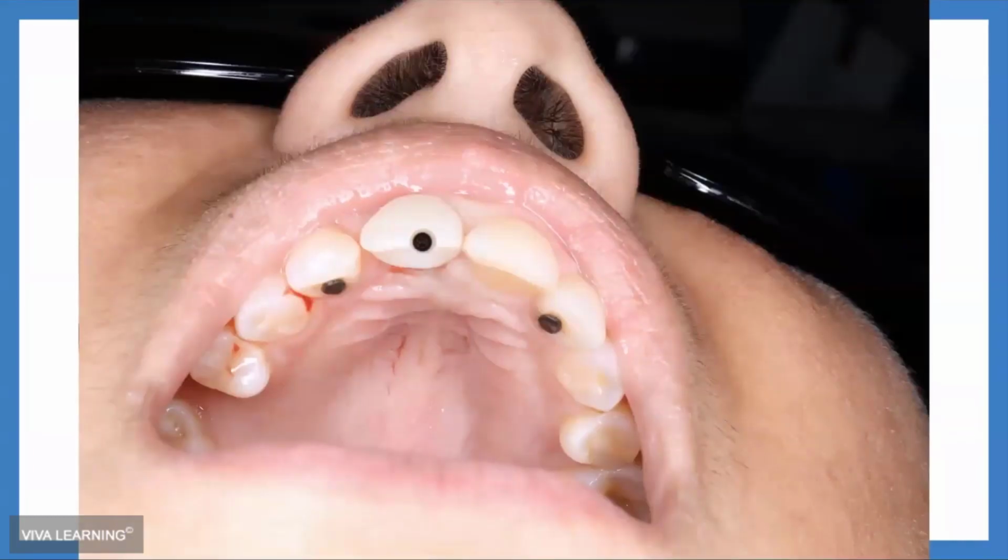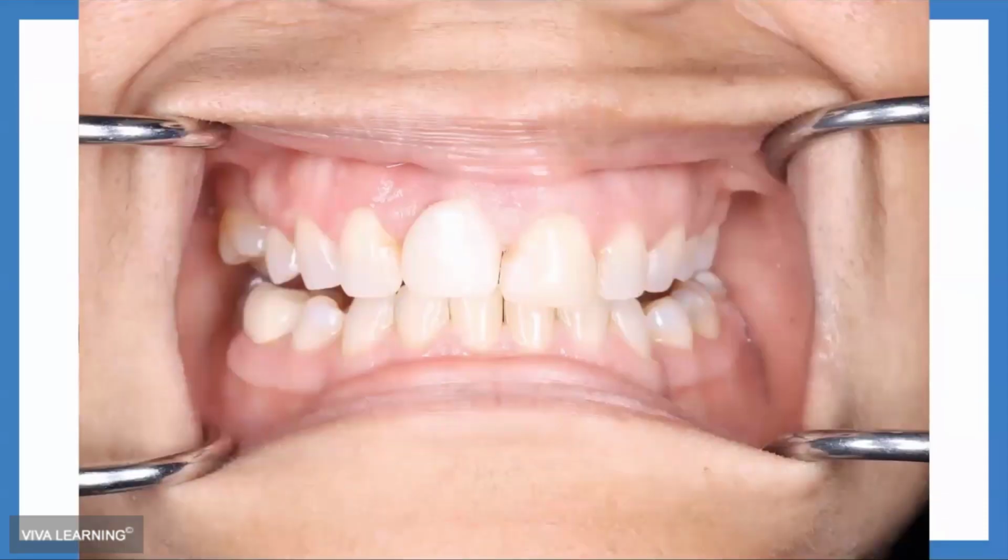So then I placed the implant. We kind of overshot it a little bit. It's way overvalued here. It's a pretty looking crown, but it's just too light. And, based on where we had left that Essex retainer, the margin discrepancies there, but she had that same discrepancy before surgery.